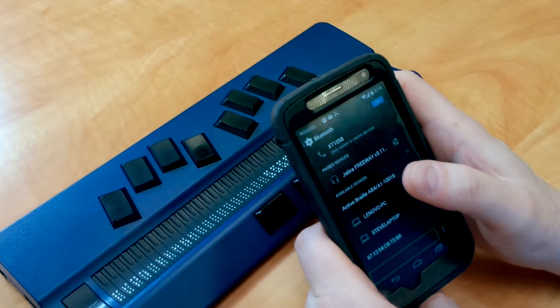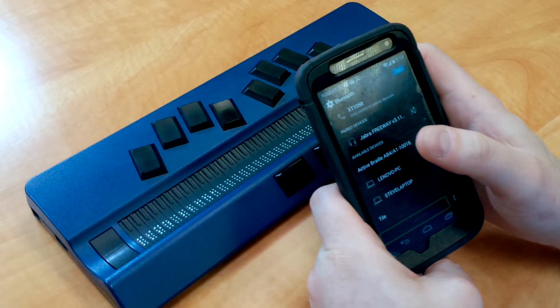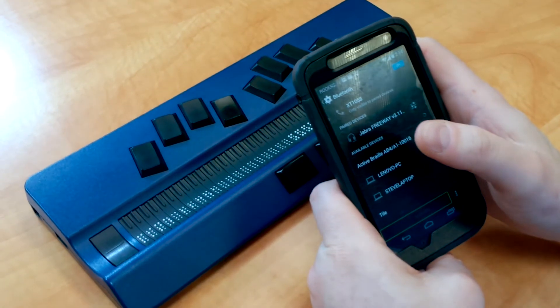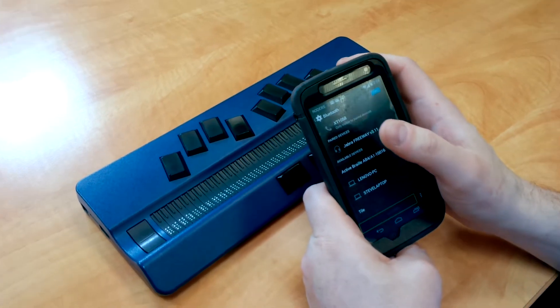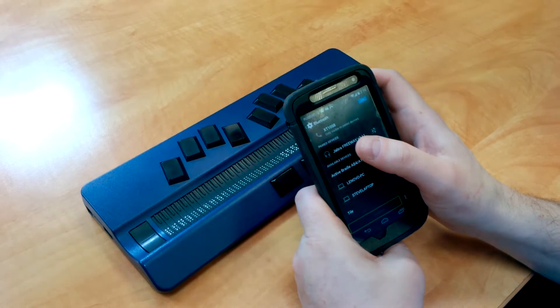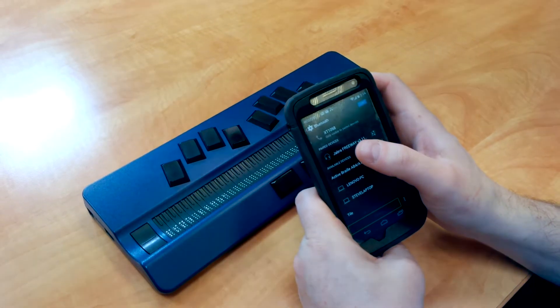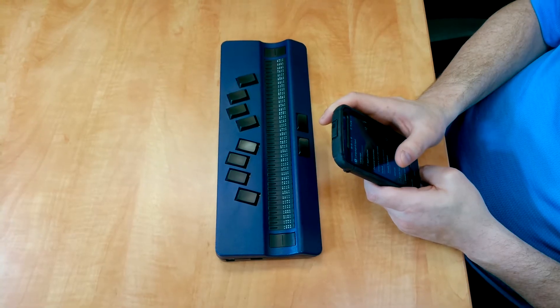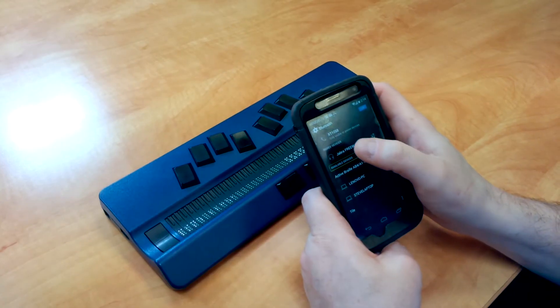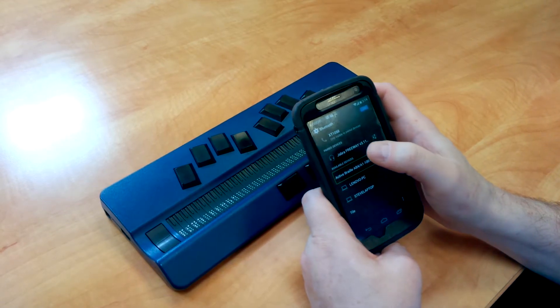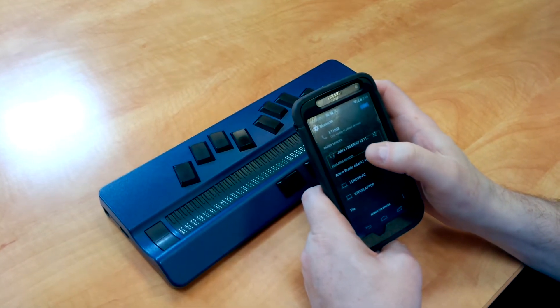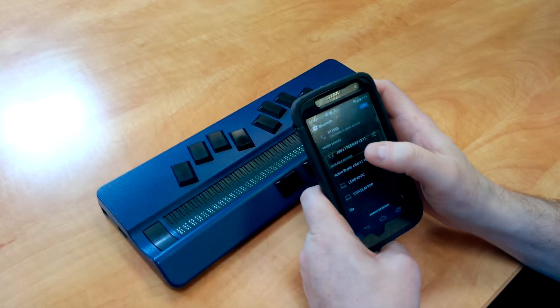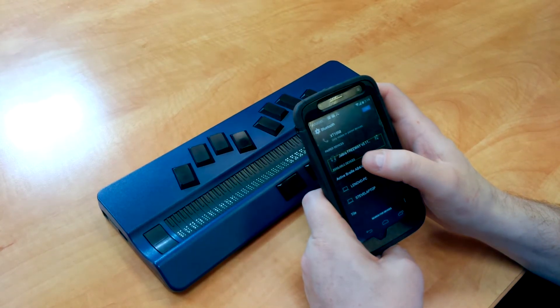Showing Item 1 of 6. Showing Item 1 of 9. My device has now found a bunch of Bluetooth devices. I'm going to see if Active Braille is one of them. There's the Active Braille, so I'm going to double tap that.